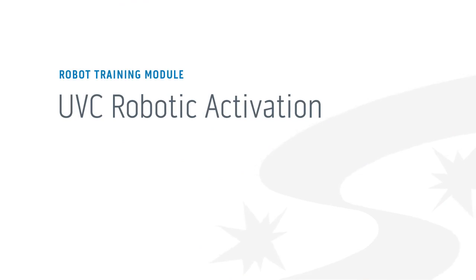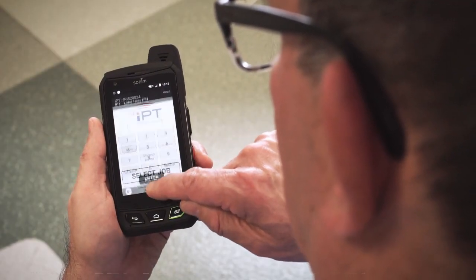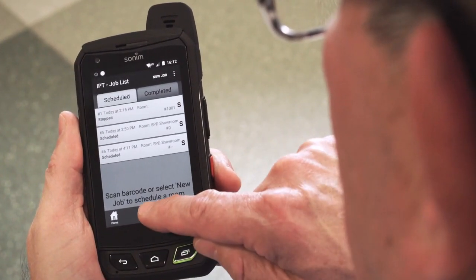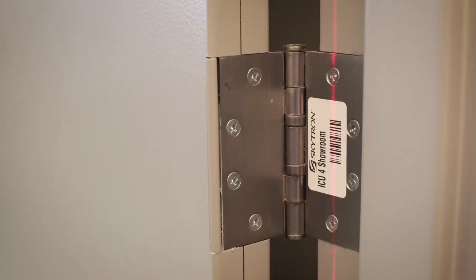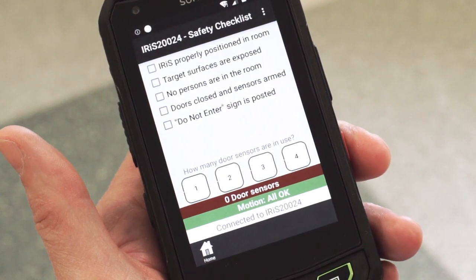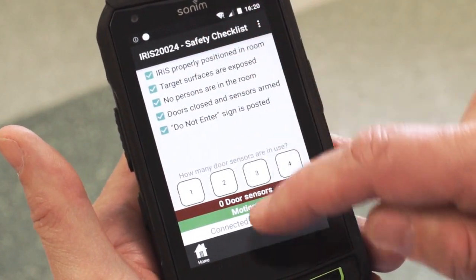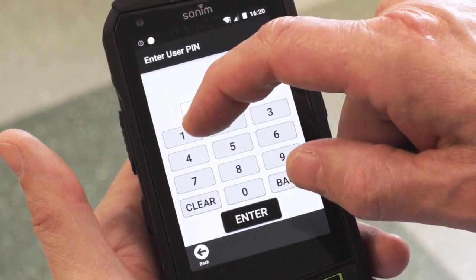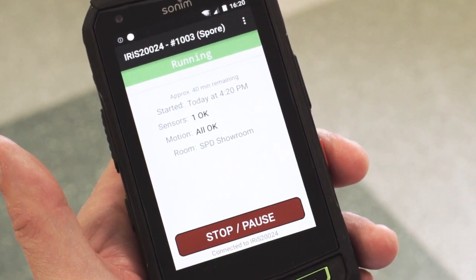Once the room is fully prepped, we can begin activation. First, confirm no person is in the room, then close and secure all doors. From the home screen on the handheld, choose the Select Job button. You'll now see the job list screen — create a new job, then choose the room. Using the middle left button on the handheld, scan the barcode attached to the door frame or hinge. Ensure a spore treatment is selected and press save. Make sure the robot is properly positioned, target surfaces are exposed, doors are closed, sensors are armed, and the Do Not Enter sign is posted. Select the number of door sensors in use and select Start. Before treatment begins, you need to enter your PIN — never use another person's PIN. Don't ever enter the room, even if the lights are off, until you see the completed message on the handheld.